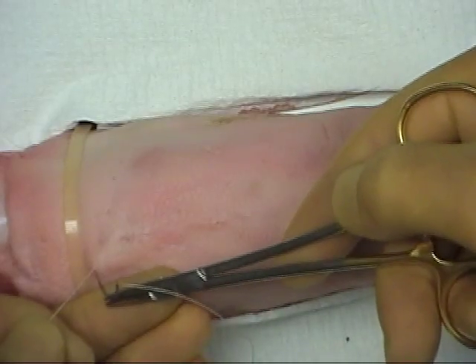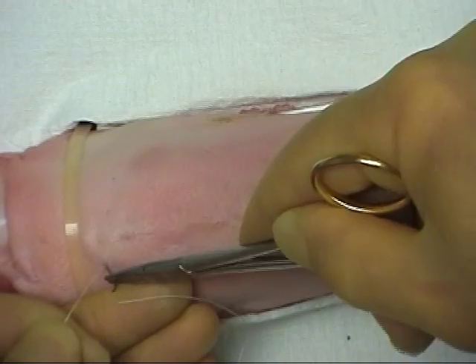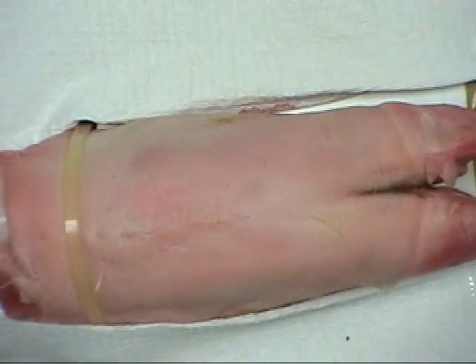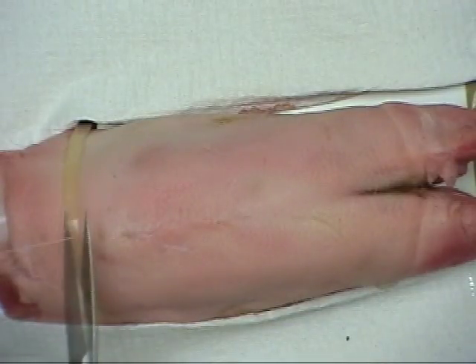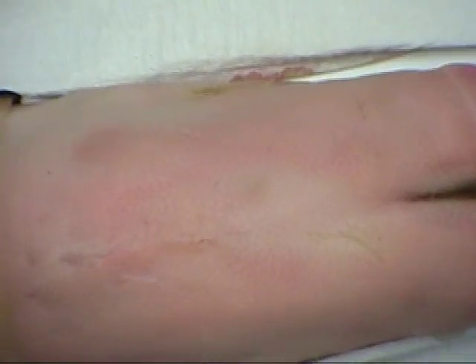To complete the Z-suture, the needle is again inserted at the previous exit point and driven perpendicular to the wound. The suture is then divided flush with the skin surface, leaving the wound closed with no visible suture.